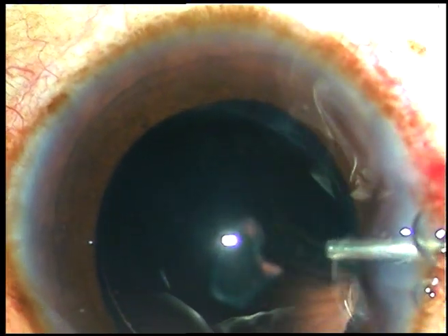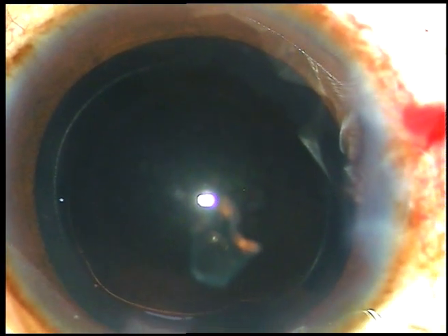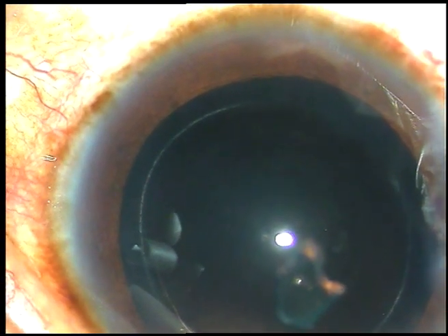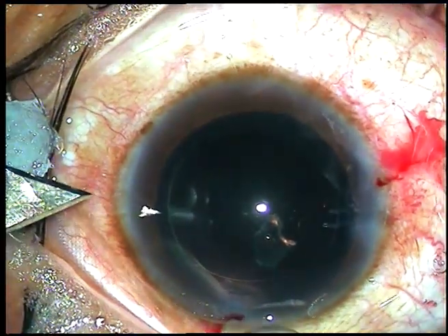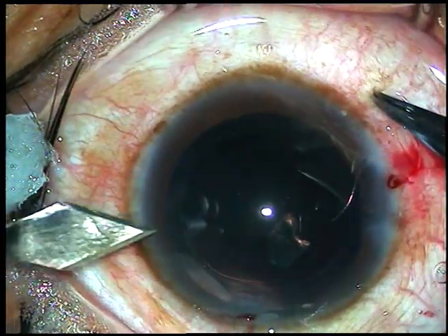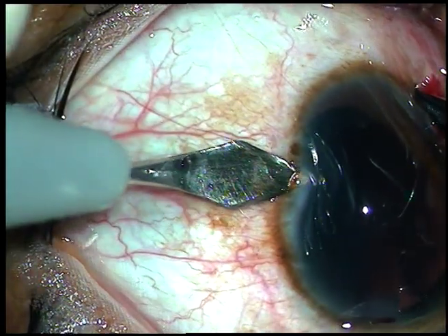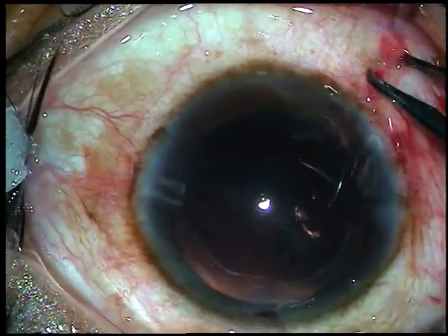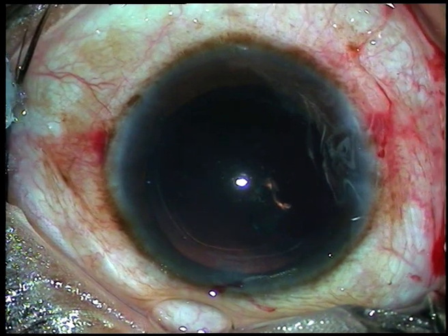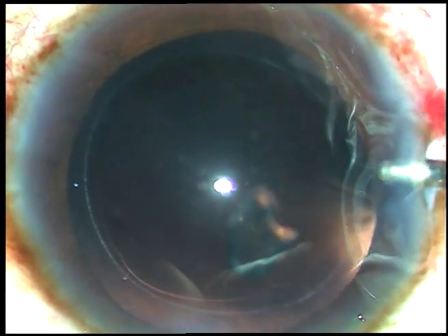Now viscoelastic substance is injected into the anterior chamber. Before implanting the foldable intraocular lens, I am going to make a full thickness limbal incision 180 degrees away from the main incision after injecting viscoelastic substance. This is a full thickness 2.8 millimeter incision. This combined with the main incision, which will be enlarged further, will reduce the astigmatism a lot.